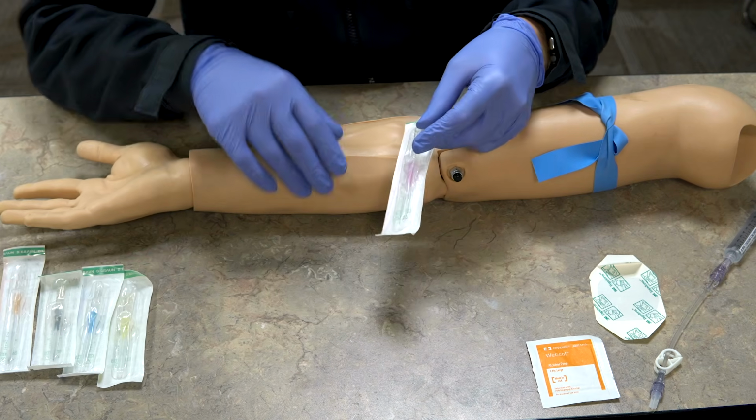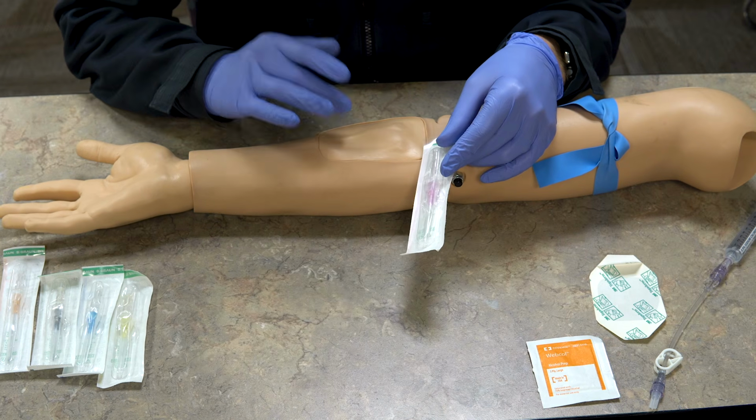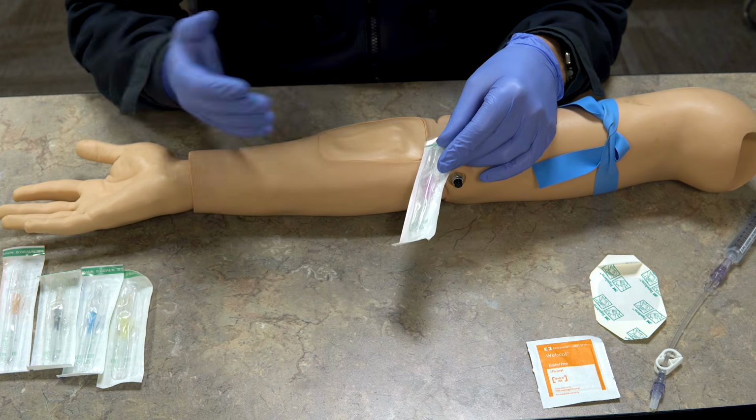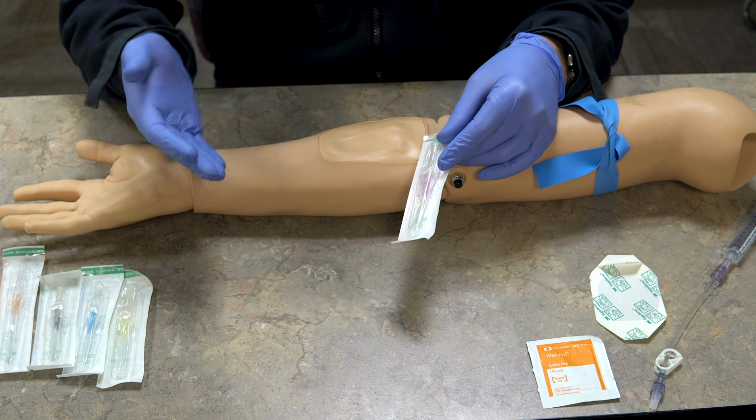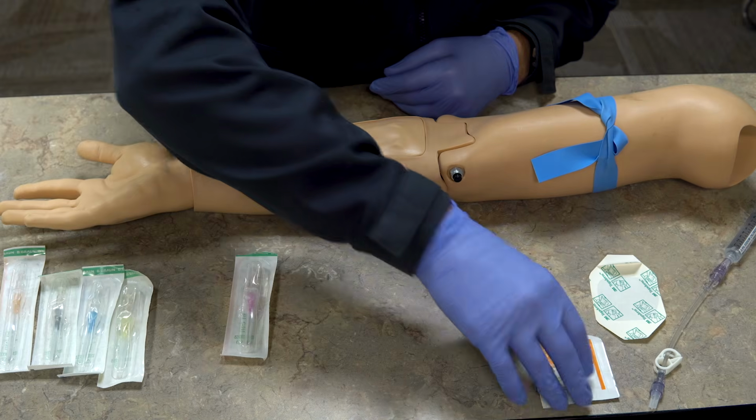And it is a lot harder to start an IV on a real person than it is on a mannequin. These mannequins you can't fail. And I will tell you, this doesn't have any blood in it, so you're not gonna see flash in the chamber, but I'll explain what that's all about as we go. So I have the IV catheter.